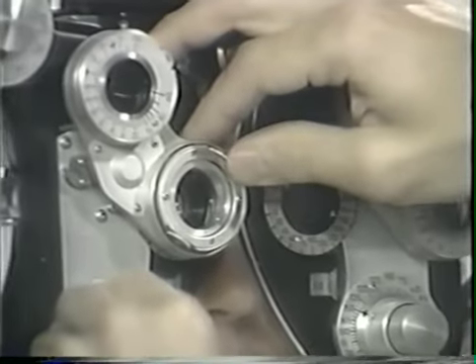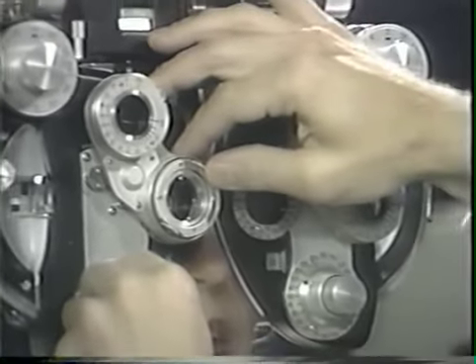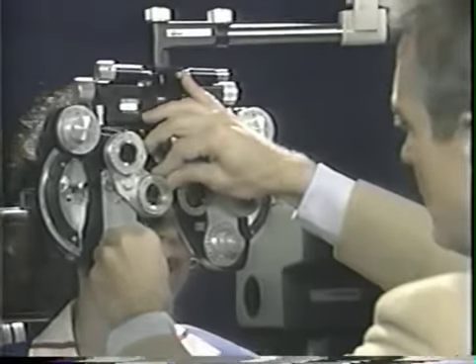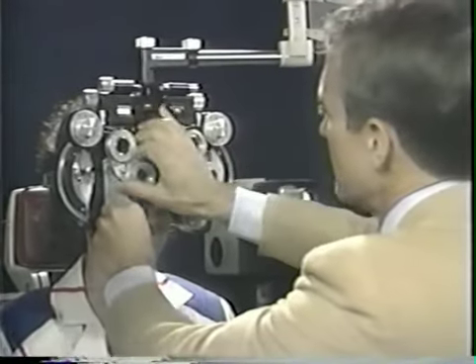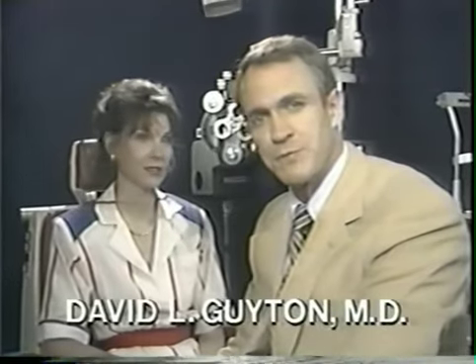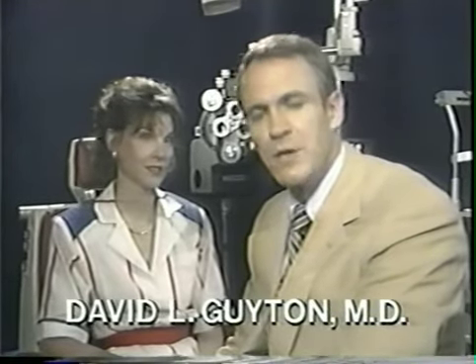in subjective refraction. This program presents the basic theory and clinical steps of subjective refraction using cross-cylinder techniques, as demonstrated by Dr. David Guyton at the Wilmer Ophthalmological Institute of the Johns Hopkins University. Subjective refraction begins with taking the visual acuity and ends with writing the prescription for glasses or contact lenses. We'll demonstrate the determination of sphere, cylinder, and axis, binocular balancing, and measurement for reading aids. Over-refraction techniques and cycloplegia will also be discussed.